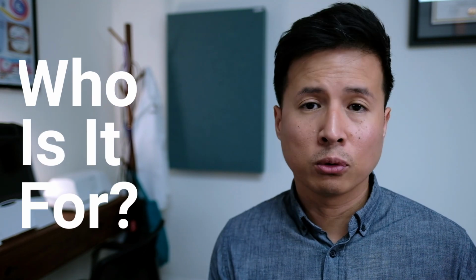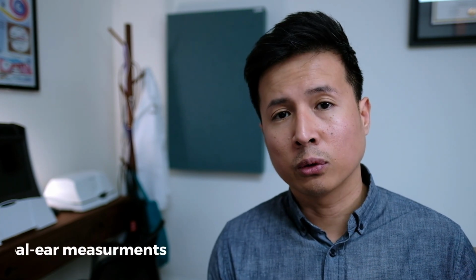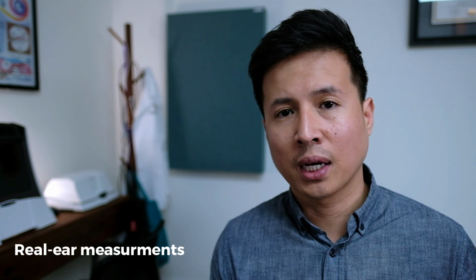Essentially, it can work well with almost any degree of hearing loss as long as it's fitted appropriately by your hearing care professional, hopefully using real ear measures to ensure the most optimal fit, and with follow-up care to ensure that you're getting the most out of your hearing instruments. But here are a few specific scenarios where I feel the Widex Moment Sheer would be especially well suited for.